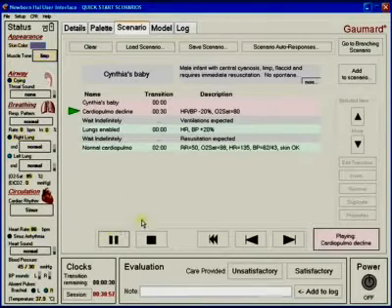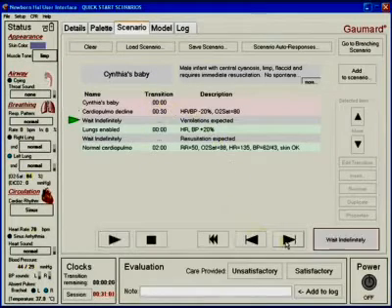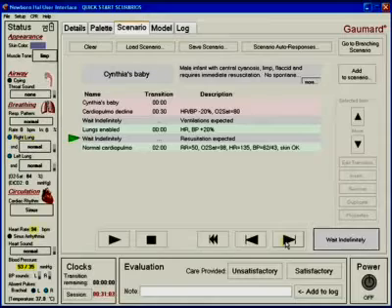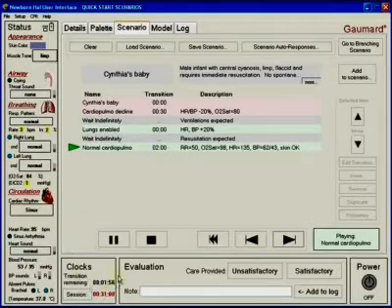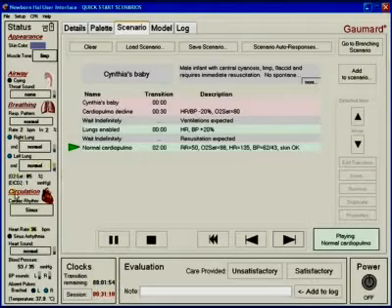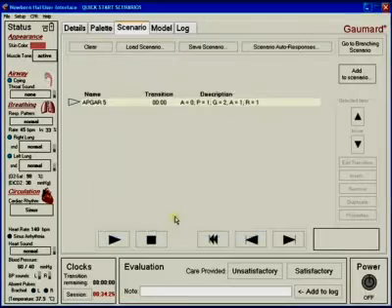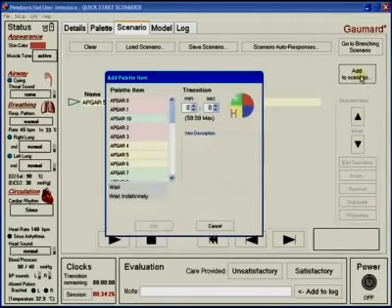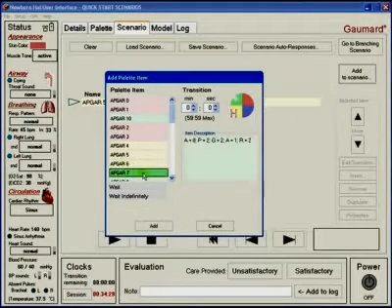With newborn HAL, there are two types of scenario that can be programmed. The normal scenario is a collection of palette items that play sequentially over a set time period. This is the most straightforward of the two scenario types. The selected palette items are easily manipulated to adjust the flow and timing of the scenario presentation.